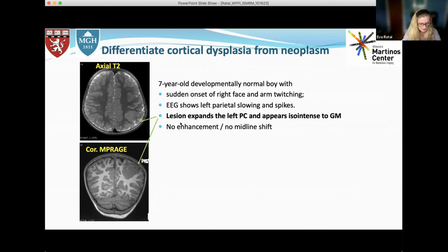So typically I ask the residents, fellows, and attendings, so what is this? But I muted you all. So anyway, 99% this favors cortical dysplasia. Of course, because it looks like a textbook case, there's always one wise guy who says, oh, maybe it's the opposite of what I think it is. But anyway, it looks amazing.